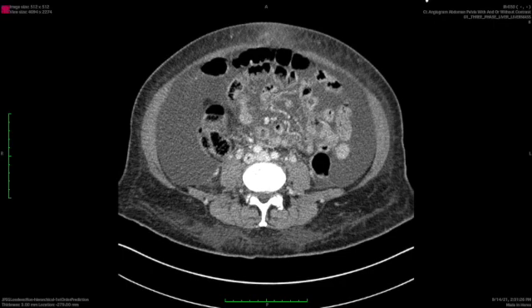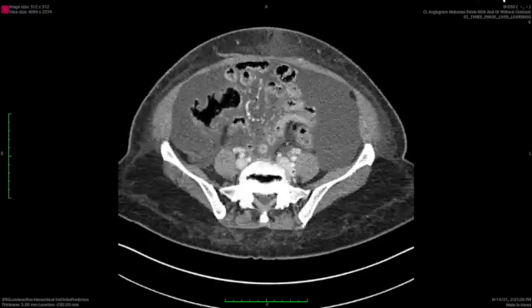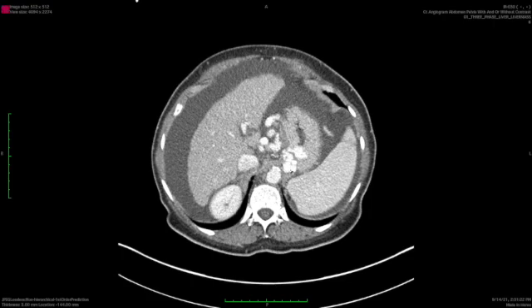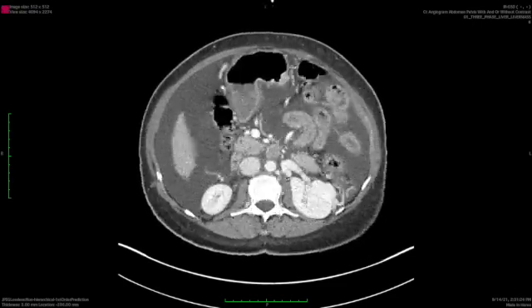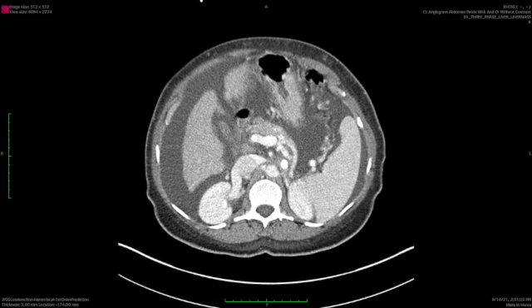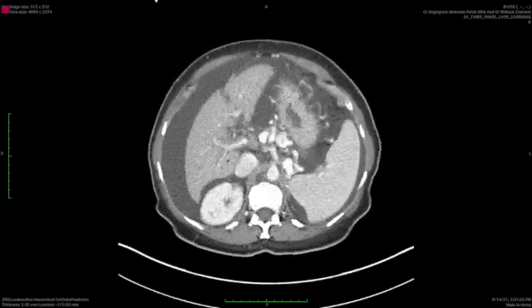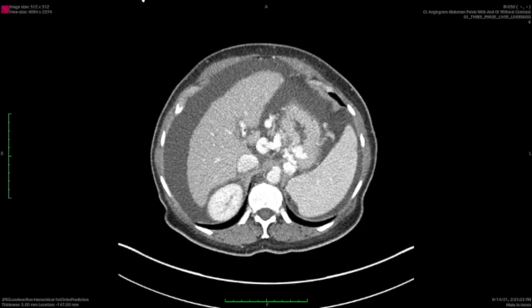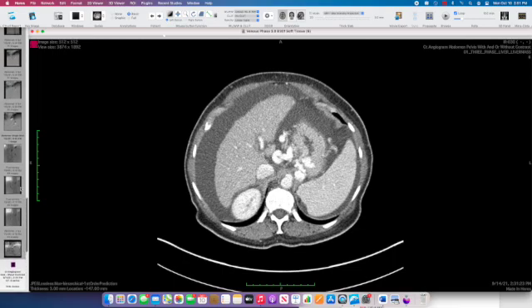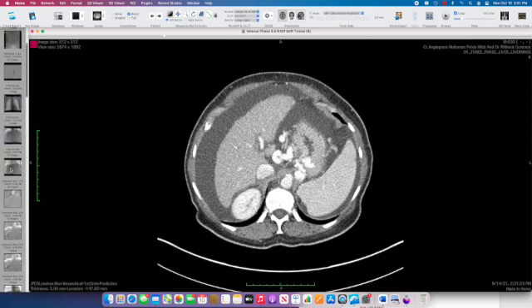So we had to do these two procedures in combination: a TIPS, and also what's typically termed a BRTO — balloon occluded transvenous retrograde obliteration — of the gastrorenal spontaneous shunt. We don't typically use a balloon anymore to occlude that connection; what we do instead is use a plug, so some people will call that a PARTO. The goal is to stop the blood flow from skipping the liver, push all the blood flow back towards the liver, and then give the body a new escape route by shunting between the right portal vein and the right hepatic vein, so that pressure is better, more blood goes towards the liver, and hopefully we'll decrease the size of all these varices and stop her from creating ascites.